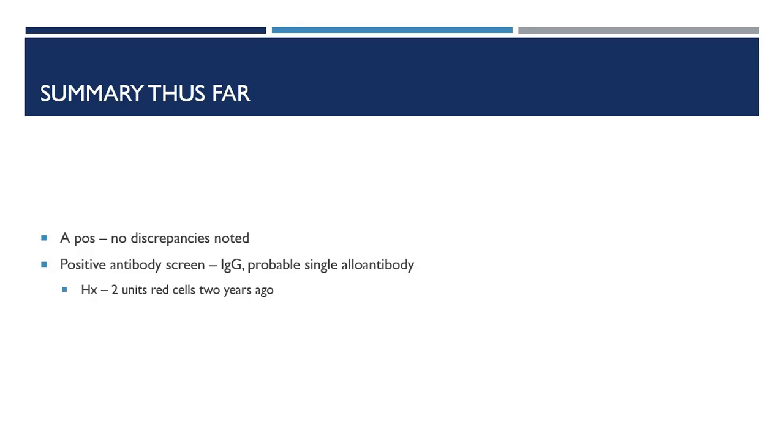So the summary of the case thus far while I'm sitting and waiting for incubating. This is a good idea to always put together a summary, because you never know when you're going to get a phone call. Like the physician or the surgeon may call and say, what's going on with the patient?